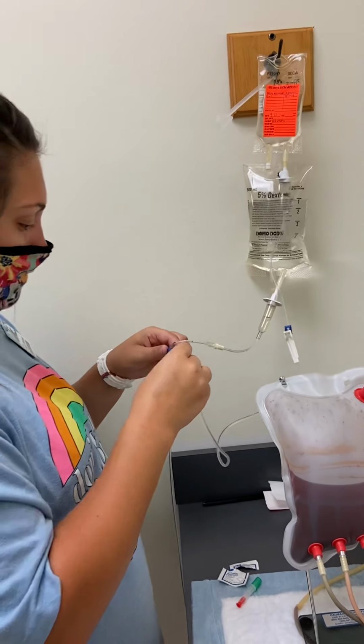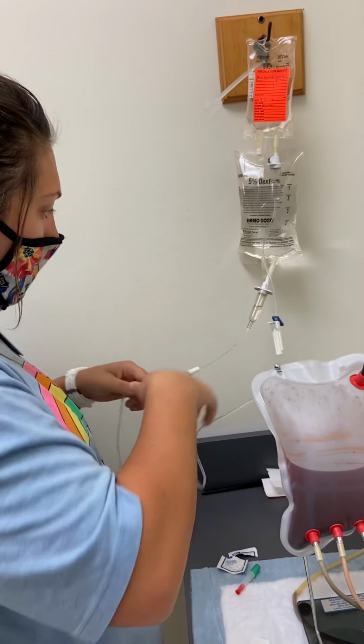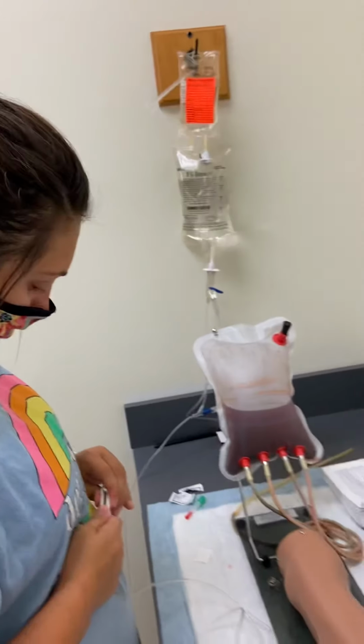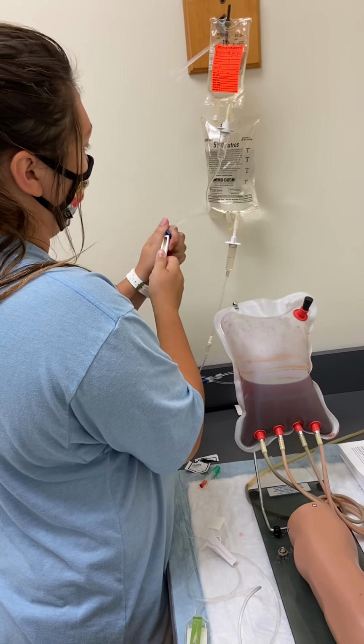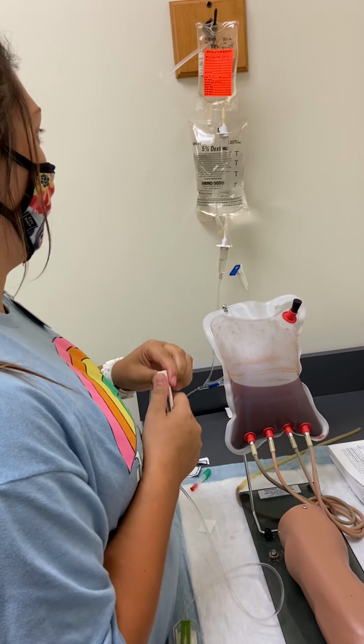It goes into the site closest to the primary. Make sure both of these are open. And they are. I'm going to be giving this over 17 drops a minute. I'll control it with this.